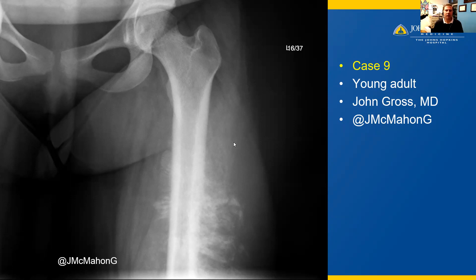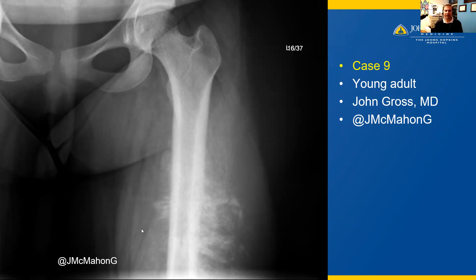Here we have a young adult with a plain film radiograph showing a neoplasm of the left thigh. We have these radio densities growing on what appears to be the surface of this long bone, with these perpendicular arrays radiating out into the soft tissues both laterally and medially in this anterior-posterior view. You can see these perpendicular lines — the so-called hair-on-end pattern, which is a periosteal reaction.